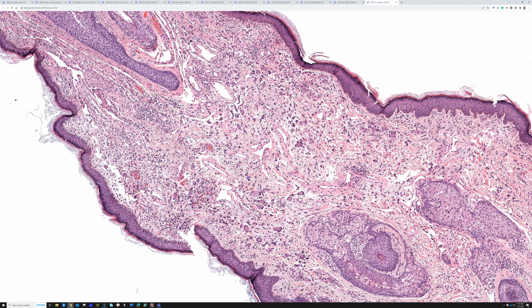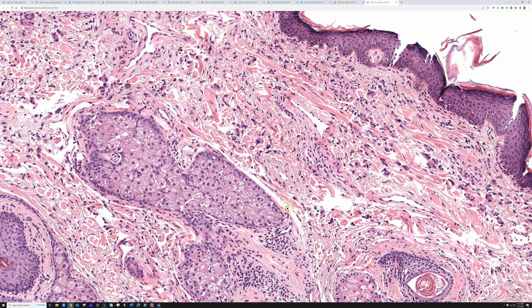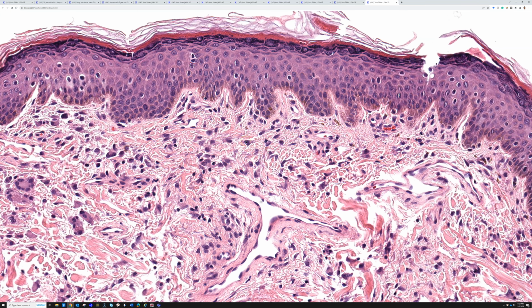So I really like fibrous papules, and the key feature that ties them all together is, again, usually they're going to be on the nose, sometimes elsewhere on the face, or rarely elsewhere on the body. And then also, if you ignore the weird-looking cells, you're going to usually find dense collagen bundles, dilated vessels, and plump spindle to stellate cells. Stellate means star-shaped, but to me, most of the cells that we describe as stellate look more like triangles.